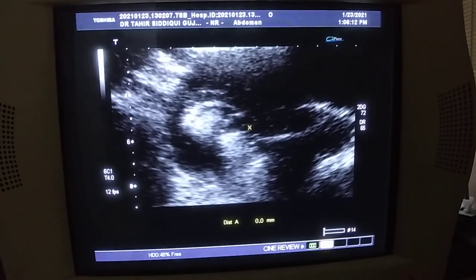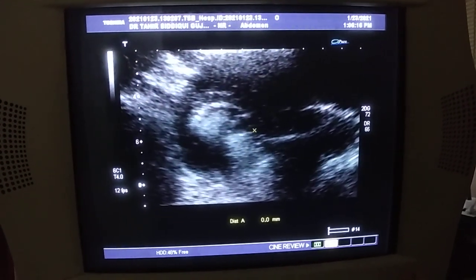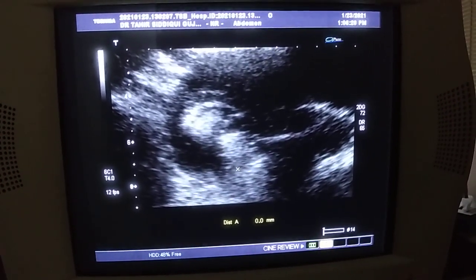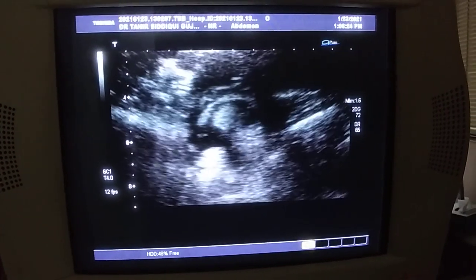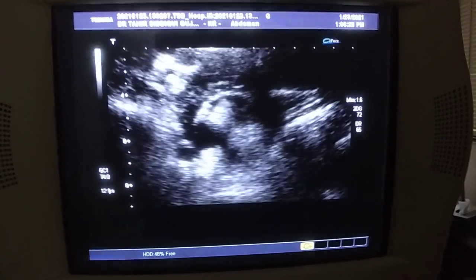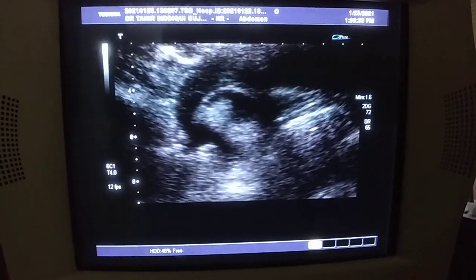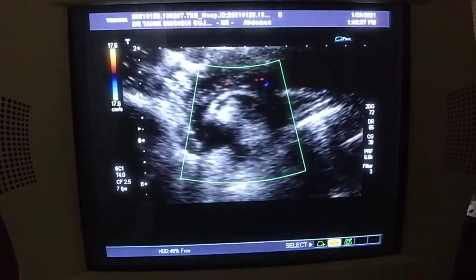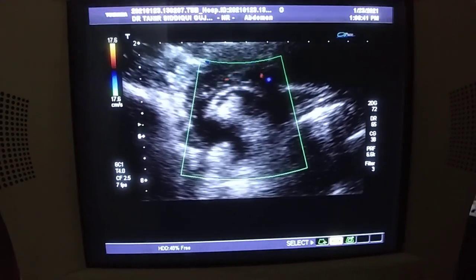This is the corpus luteum of the pregnancy which is persisting and shows organizing bleed within it. No internal vascularity is seen.